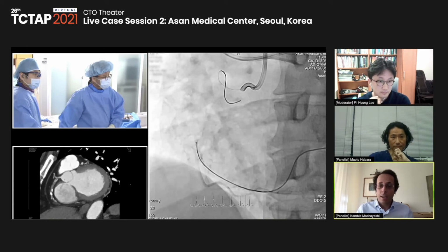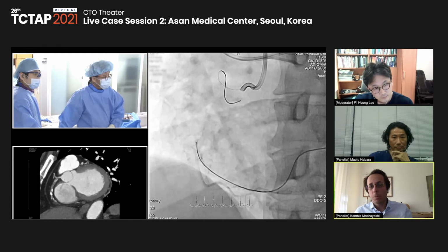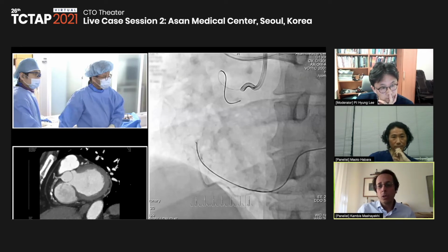And in the J-channel score, we have some predictors, which are reverse bend, corkscrew, and continuous bend, and also very small collaterals, which give us a feeling, when you analyze it, of whether you have a passing chance or not. So my question is, in your daily practice nowadays, when you study the angiogram, are you also considering those scores?